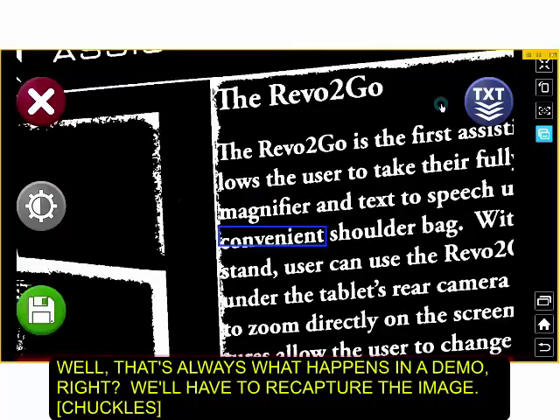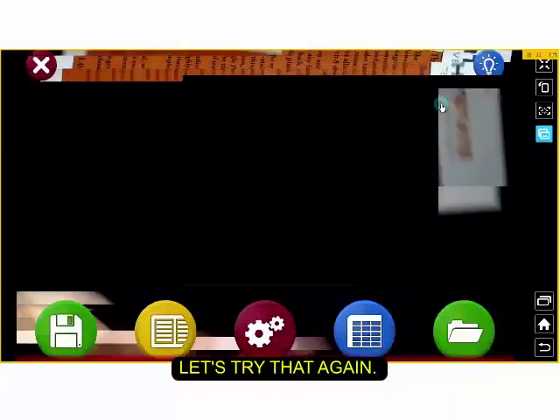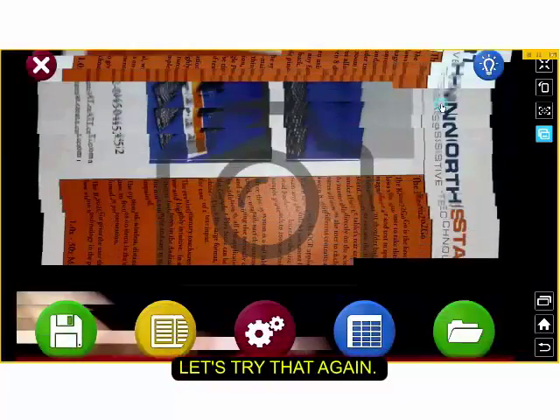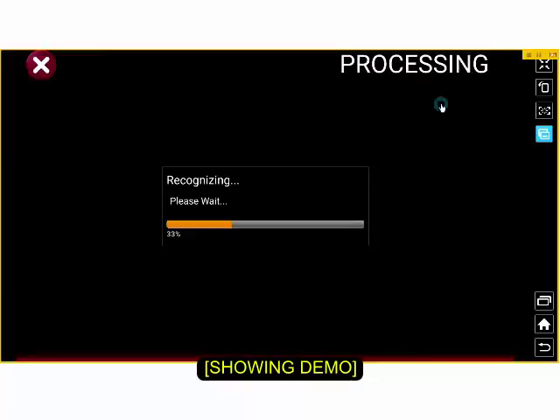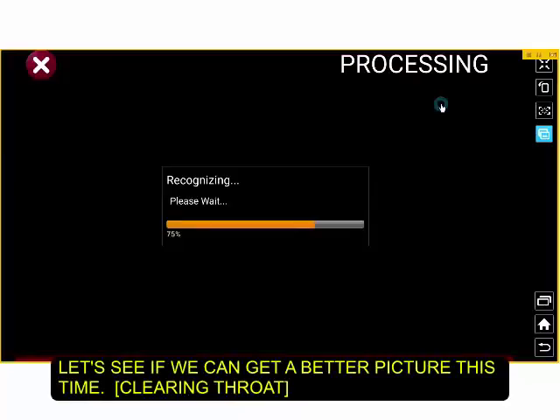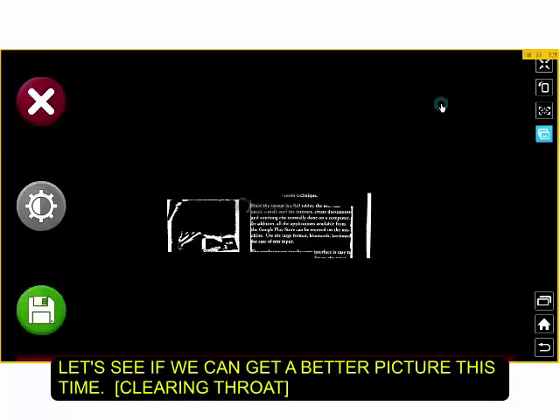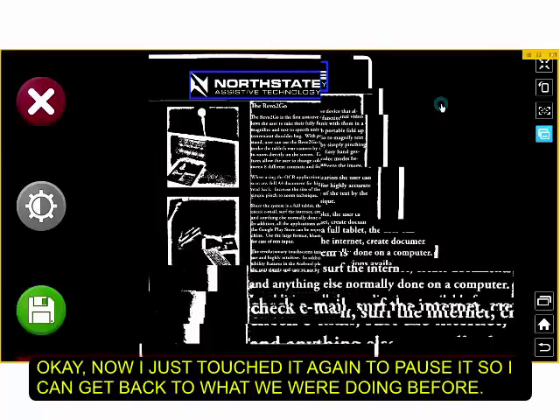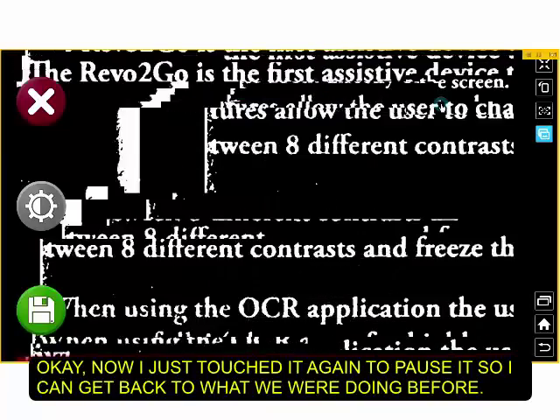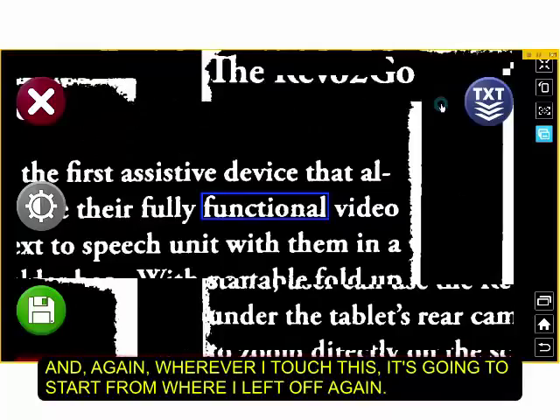Well, that's always what happens in a demo, right? We'll have to recapture the image. Let's try that again. See if we can get a better picture this time. Okay, now I just touched it again to pause it so I can get back to what we were doing before. And again, wherever I touch is where it's going to start from again.